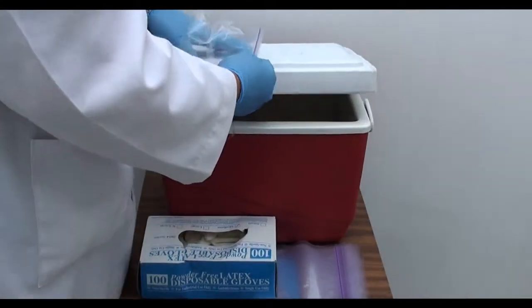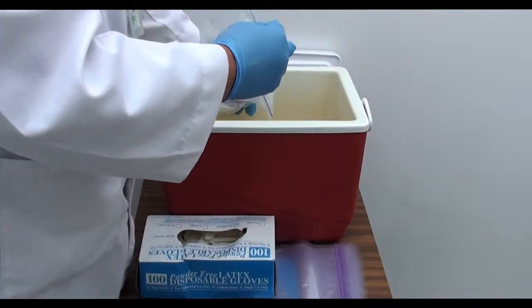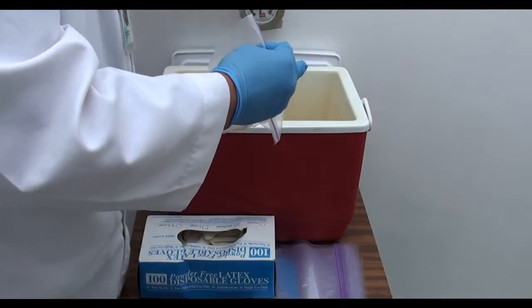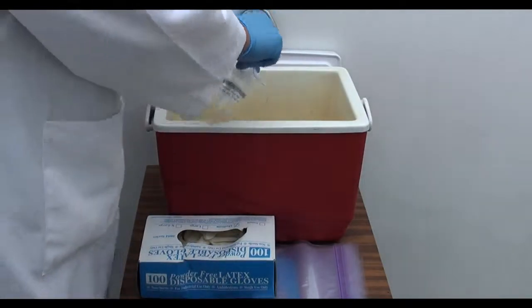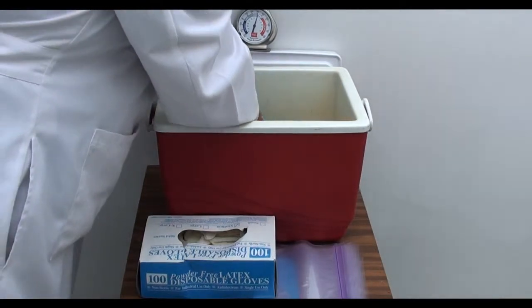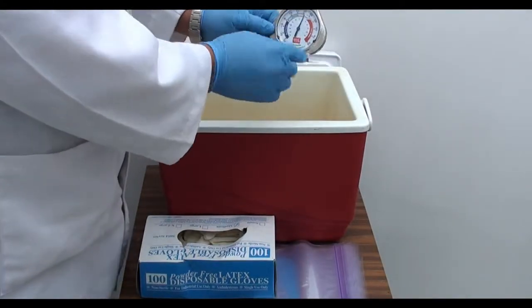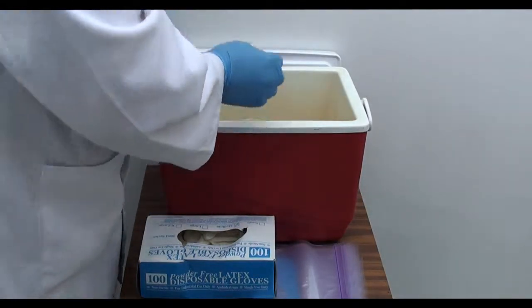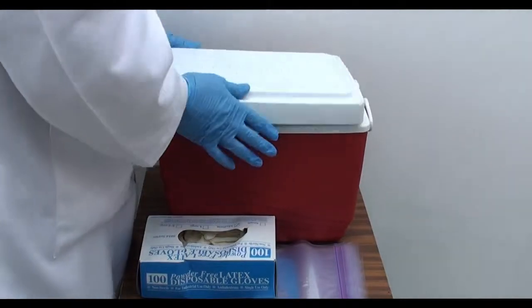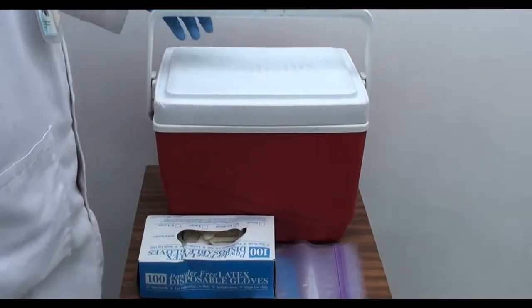They must be immediately transported to the laboratory. They must be individually packaged in resealable bags to avoid contamination or spillage. If they are not transported within the first hour after collection, they must be refrigerated or stored in coolers with thermal control between 46 and 59 degrees Fahrenheit. Samples must never be frozen.